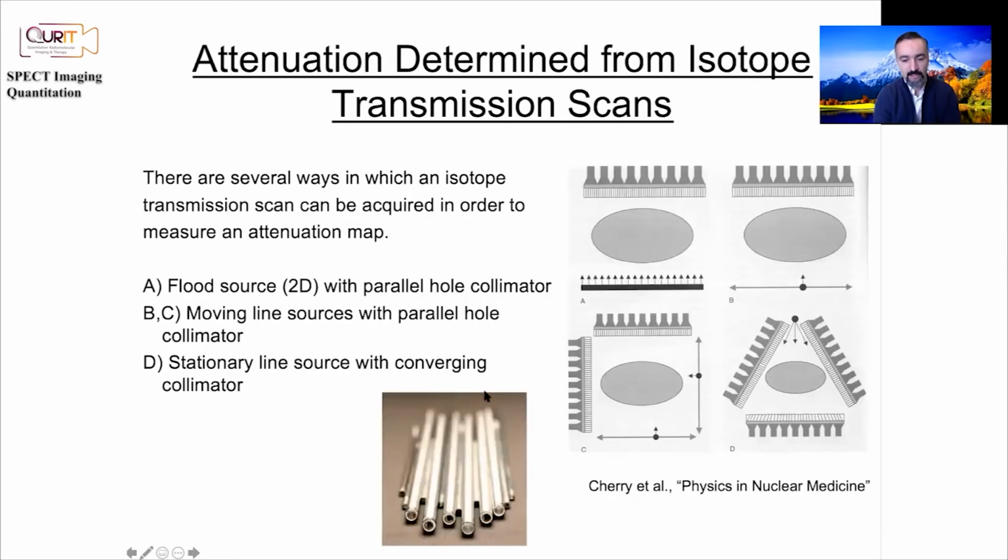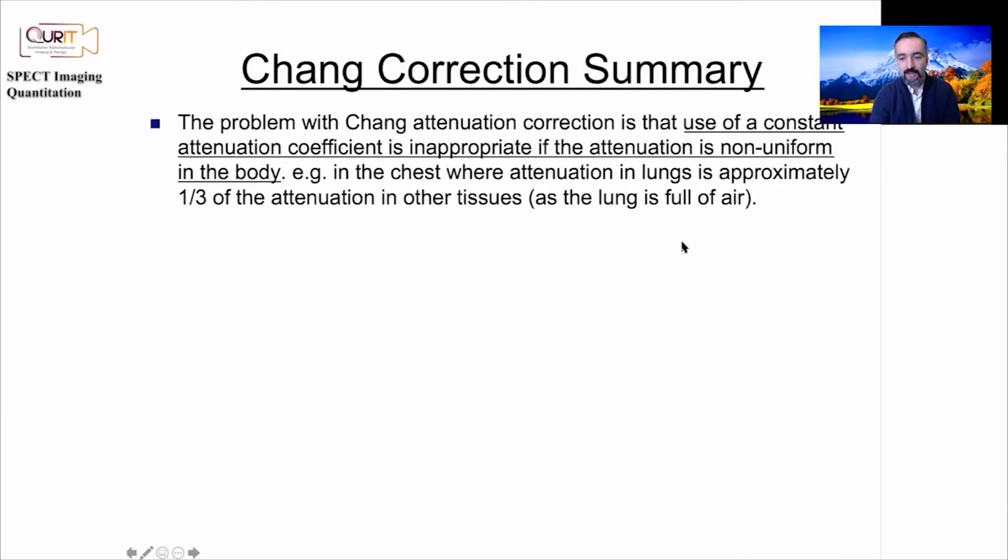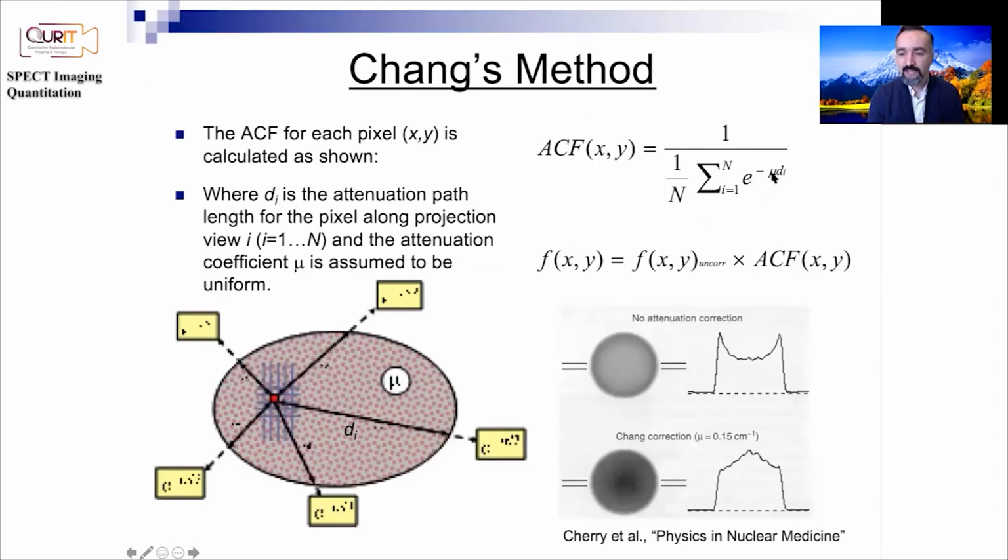So just like here, we were assuming that the mu values were uniform everywhere. But now you don't assume that. This becomes a summation itself, like a multiplication of two vectors where you have the length along this pixel multiplied by the mu value in that pixel, then this pixel, then this pixel, then this pixel.